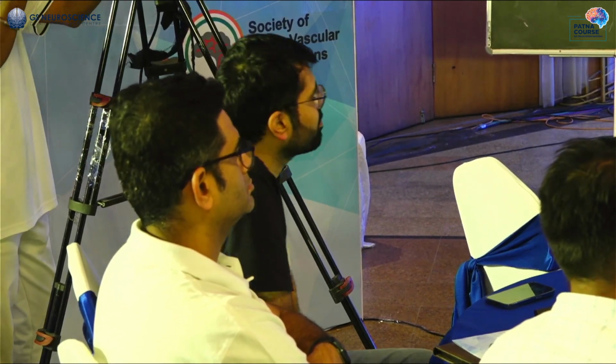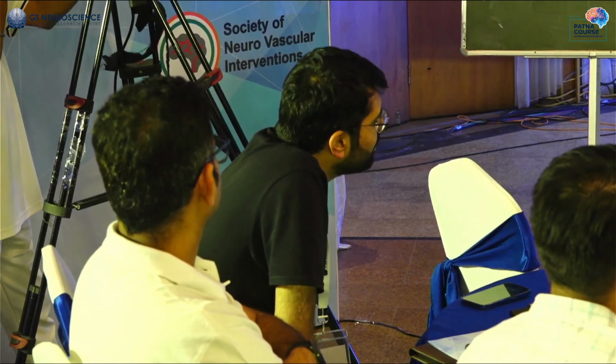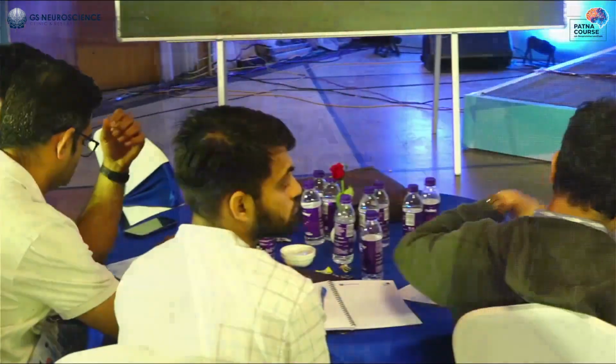Even in the direct CCF, I still like the arterial route first rather than the venous route. Of course, there are a lot of people who prefer the venous route in direct CCF, but still I think the arterial route is easier. In literature about CCF, or for that matter dural fistulas, there are conditions where the venous route is first recommended. But as long as you take the fistula and you take down the vein, what difference does it make?